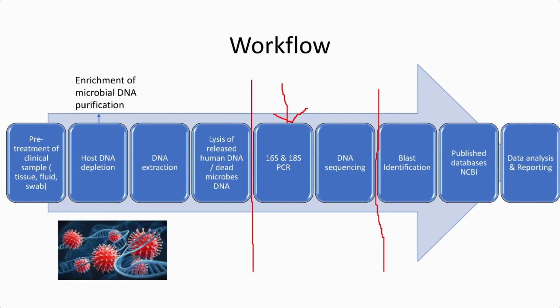Moving on, a simple workflow is explained here, and we can see that for such analysis, the first important step is the pre-treatment of the clinical sample. In order for a sequencing project to successfully give us the results that we are looking for, the sample collection and storage plays an important role. Once the tissue, nasopharyngeal swabs, saliva swabs or blood samples are collected from the patients, they have to be stored properly until the experiment starts.